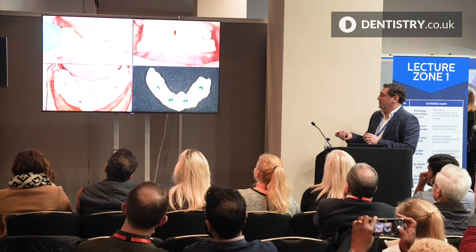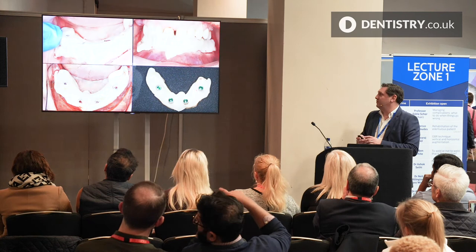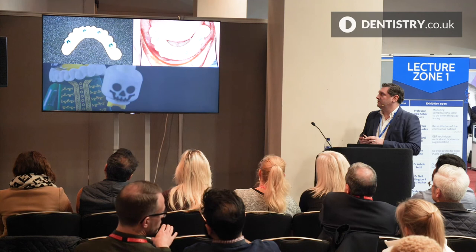So, looks a bit messy at the moment. I go and have a cup of tea. Pierre finishes it nicely for me. So it's finished off. Screw down into place, patient's happy.